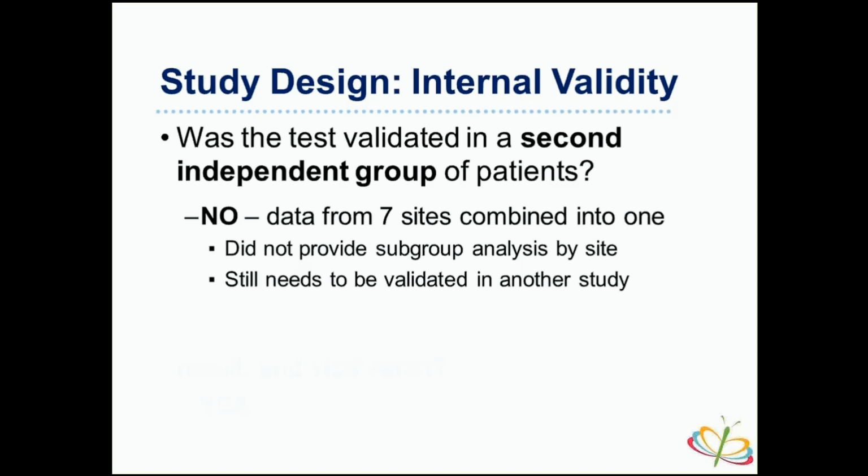They did not perform the study in a second independent group. So it still needs to be validated in a separate population, which was never done. But it's planned. Right. So, moving on.